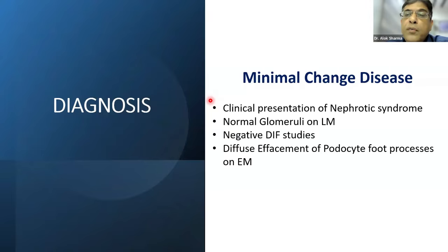But if the tubulointerstitium was absolutely fine, just as in this case, with no fibrosis, nothing, then you probably should not be calling it that way. Then it becomes a waste basket, right? For everything you can call it. But you should have valid reasons to say why you are suspecting an FSGS which is not there, right? That way.